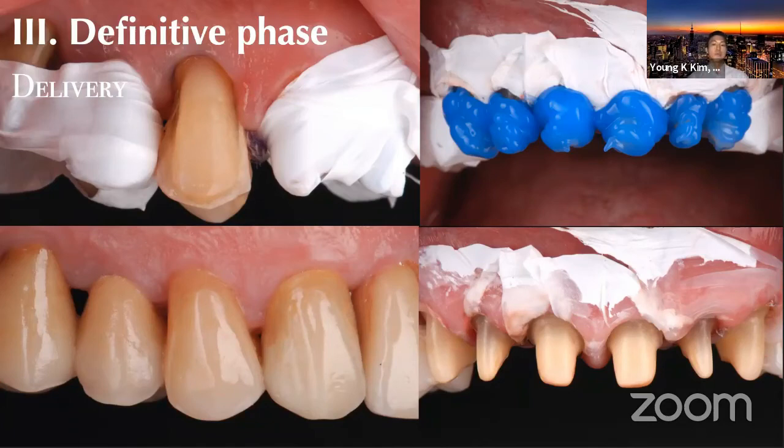I mean, you can use the rubber dam, but once you prep your tooth or you have very little retention resistance form, it's very challenging to use a rubber dam on every single prepped tooth for the full mouth rehabilitation cementation process. So I prefer to use Teflon tape, and then you can at least block the crevicular fluid area, and you control the other area of the salivary glands with the triangles, the cotton rolls, the bilateral suction tips, and you can control the saliva. And then you do those acid-etch bonding protocols, and you can do predictable cementation.